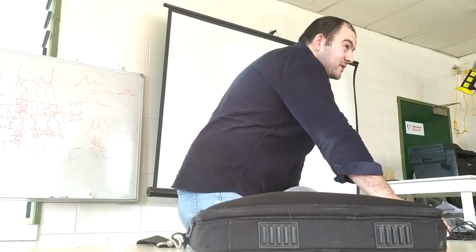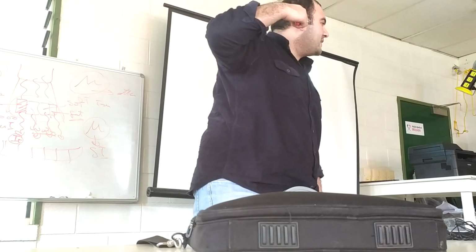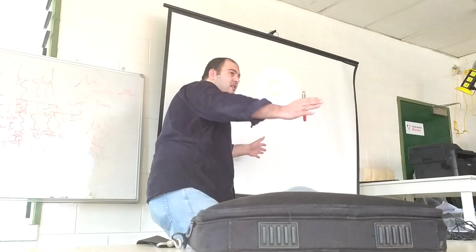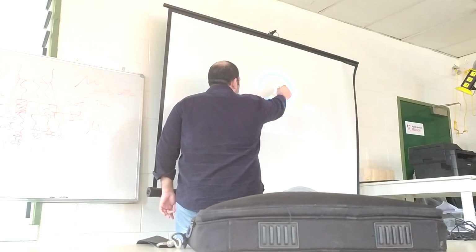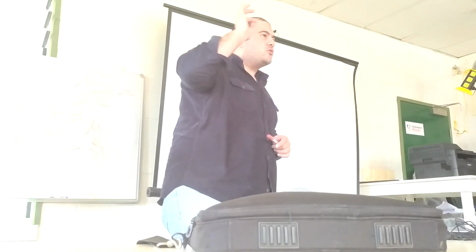But nowadays we use third generation, like our scanner here. Most scanners use this third generation, increasing the width of the fan beam angle to cover a large area of the patient, and the detector is in the opposite direction. The X-ray tube rotates around the slice or the patient, with the tube and the detector in opposite directions. Now we are covering patients in very little time. Sometimes the rotation time reaches 0.2 seconds. You can cover one slice in 0.2 seconds.